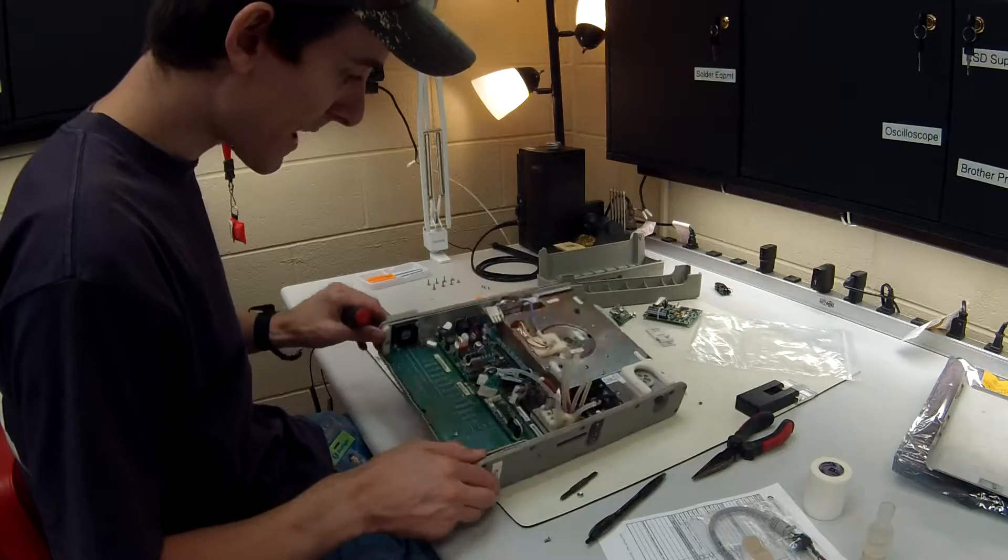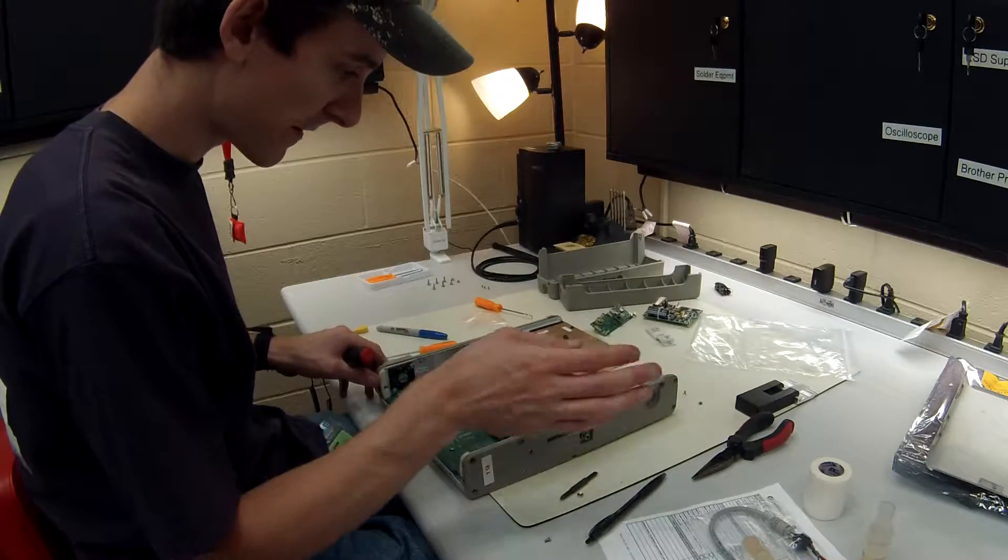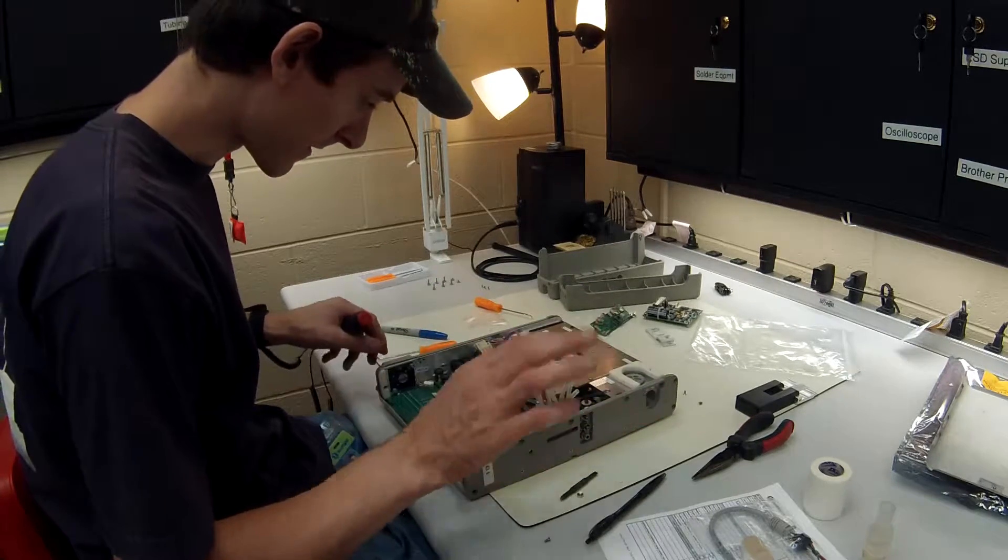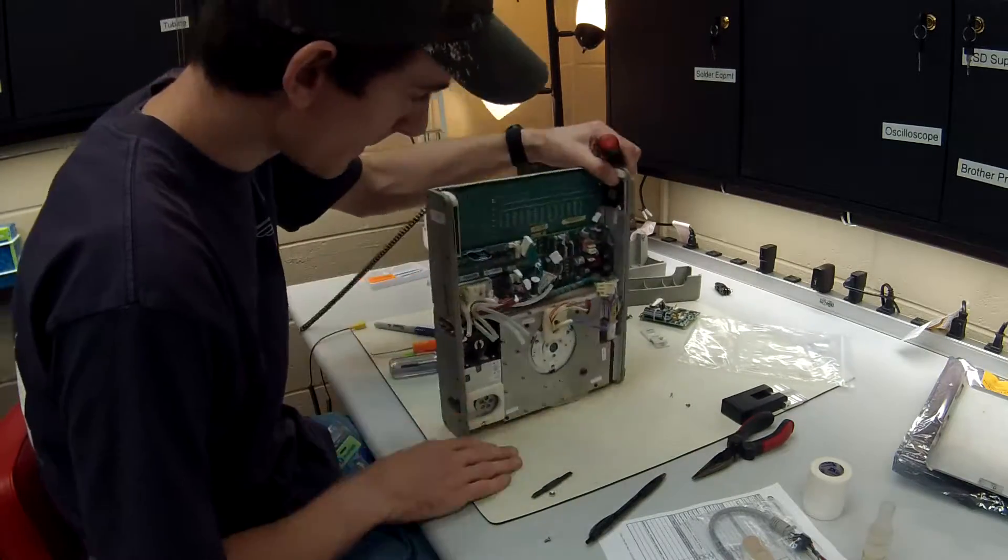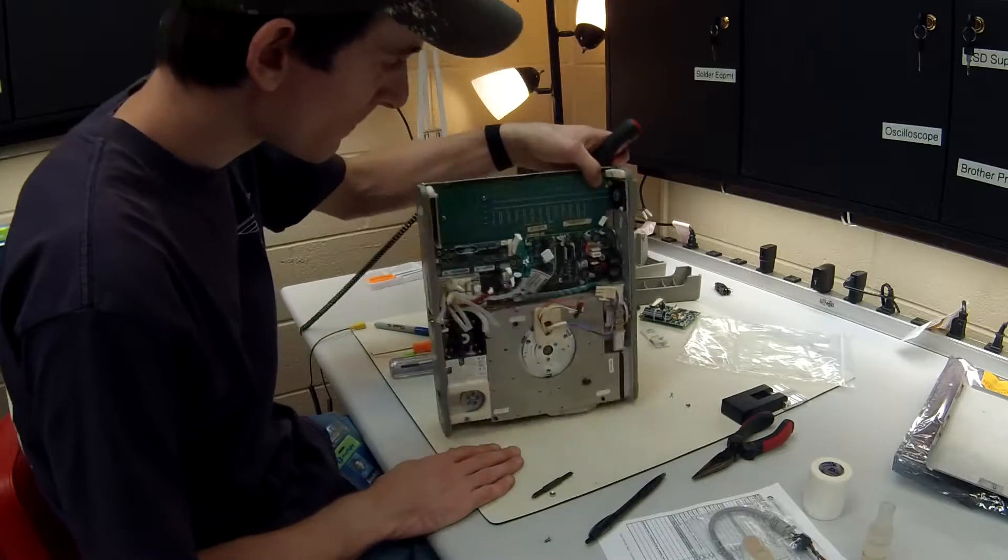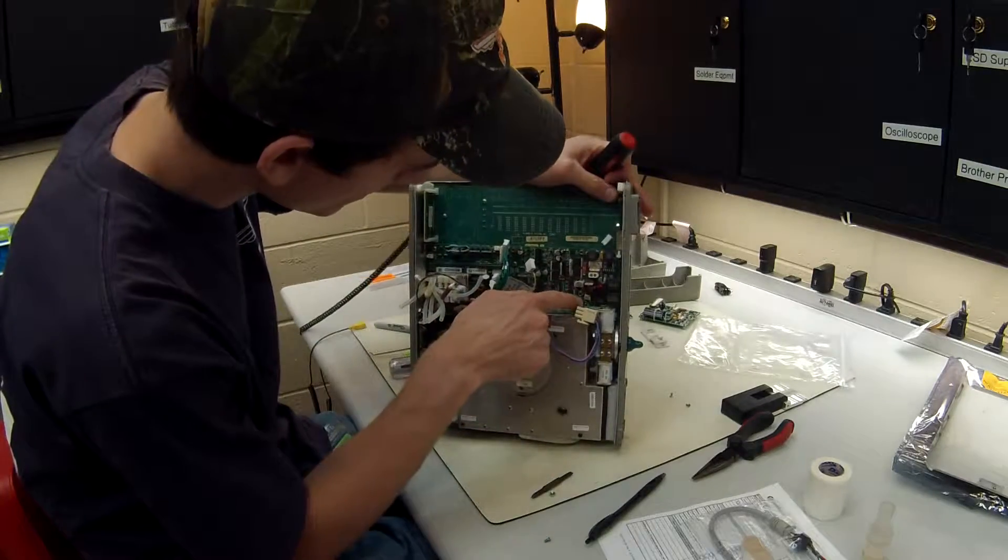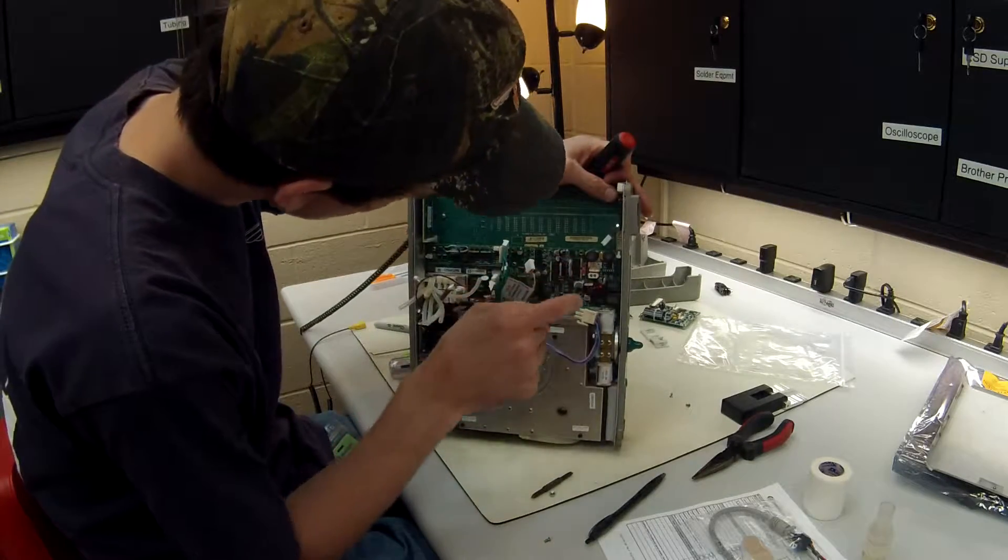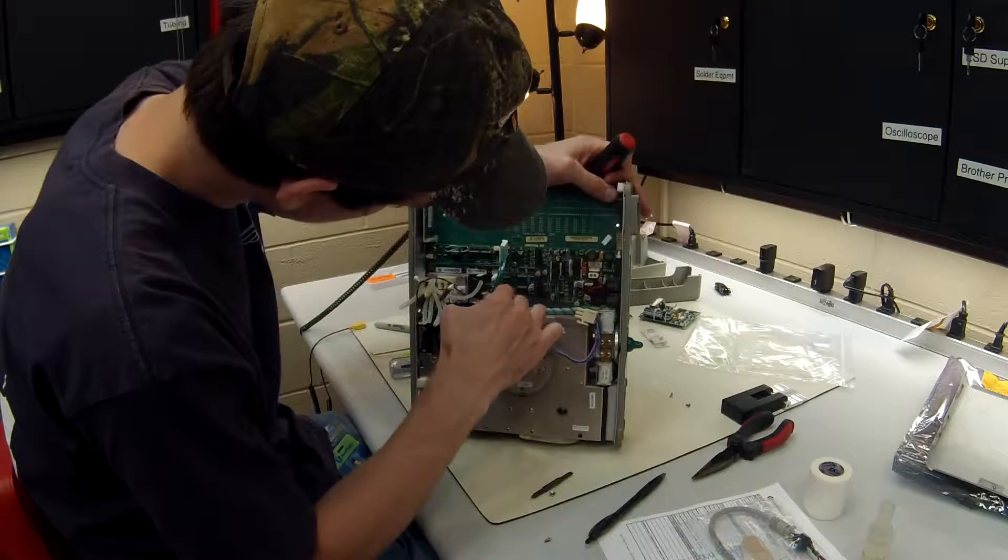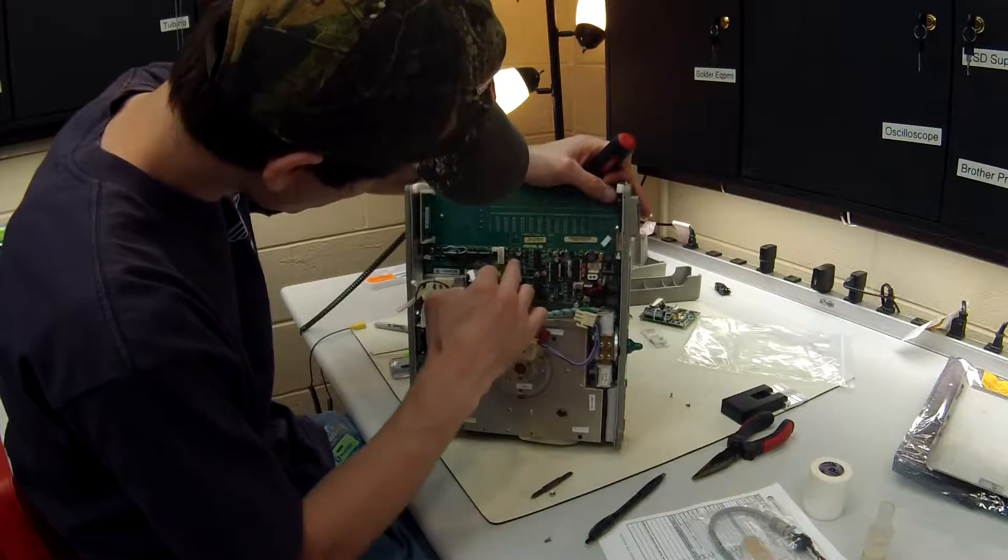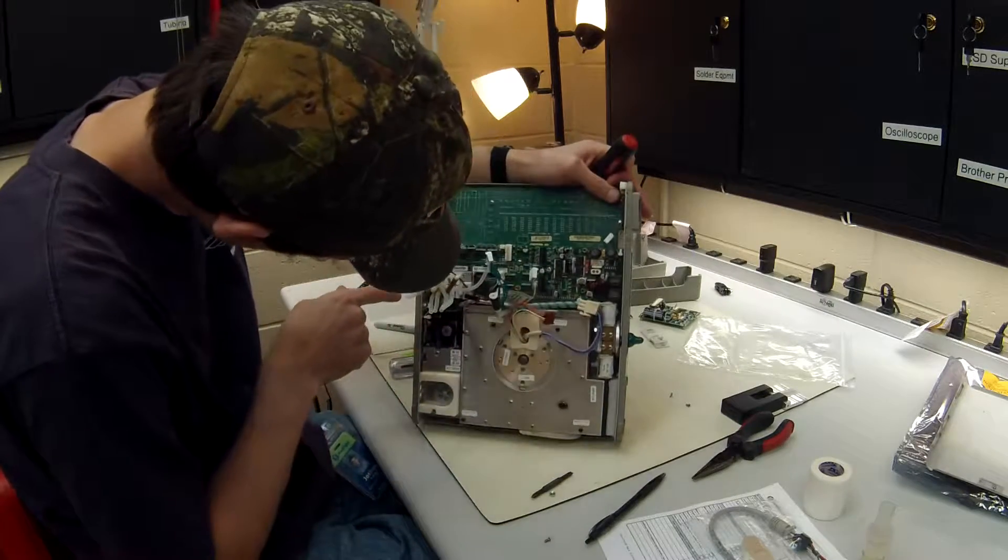Alright, we're going to remove the power board. I'm actually not going to remove that right now, it's stuck. For the time being, we're going to remove the power board screws here, here, here.